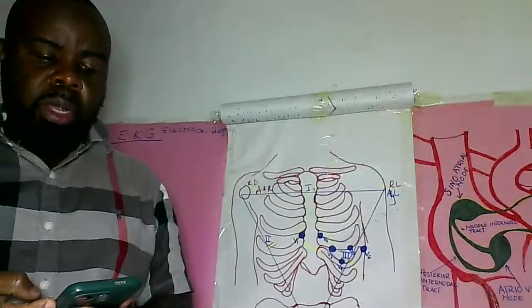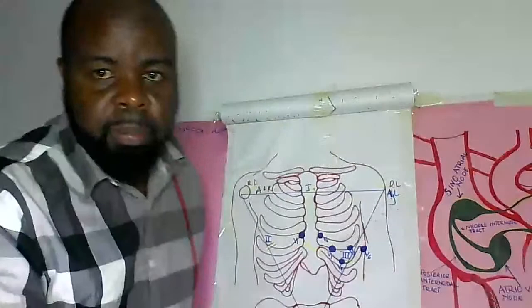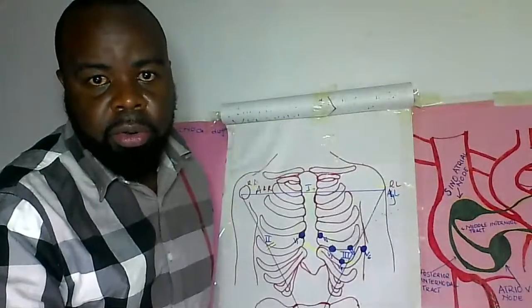Now, there are specific things that you need to know when it comes to EKG that are very important when it comes to electrocardiogram.